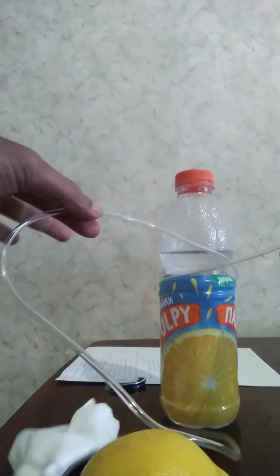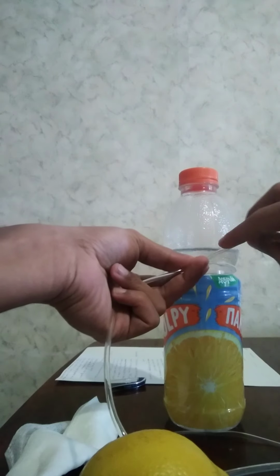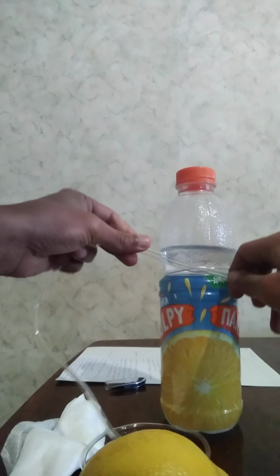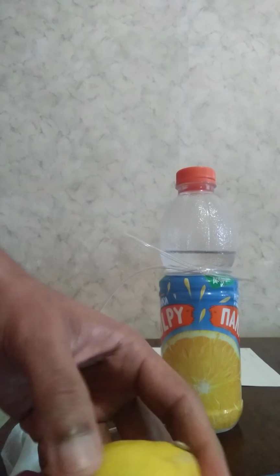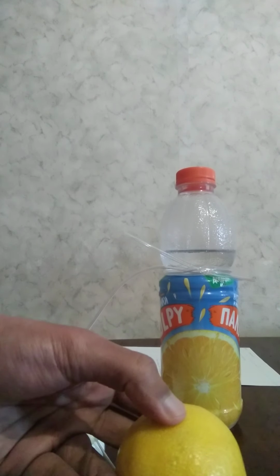take a cross where the little hand goes above the big loop, big hand. Once it's like this, we may create a loop by pushing it inwards and tighten it like so. At this point, we ask the patient to clench, to pump his fist. That way we can see the dilation of the vein, the cubital vein. So once we palpate and find the position, we must clean the area of injection.